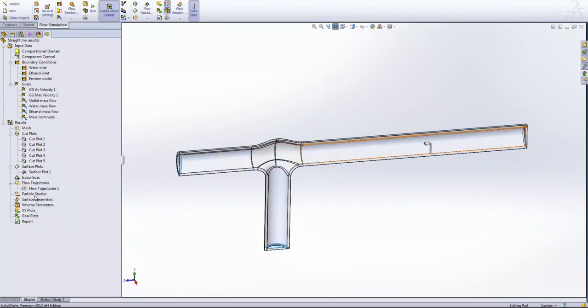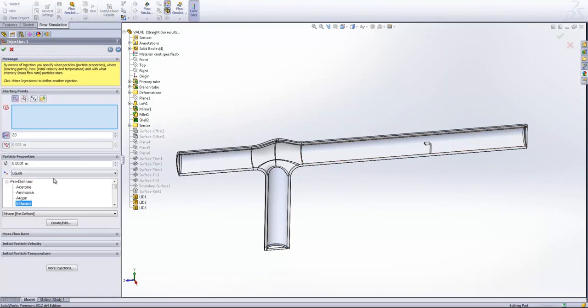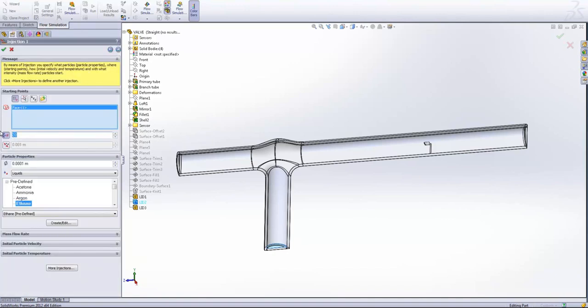Okay. Another tool we have at our disposal is the particle studies. This is very similar to the flow trajectories, but instead what we can do is select, so say for this case I'm going to use the ethanol inlet, and I'll put 50 particles in, and we can select the diameter of these particles. So this is simulating the actual presence of droplets. And I'm just going to grab the ethanol there. What this is going to do is inject particles of that size and see how they move through the flow.